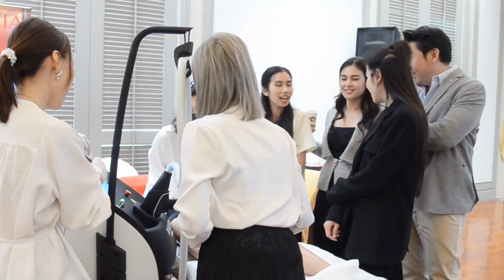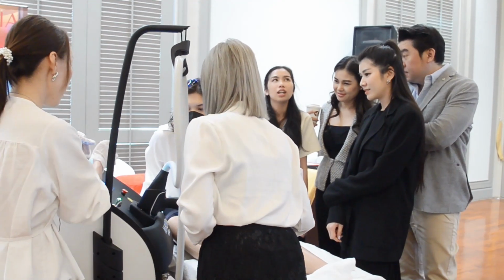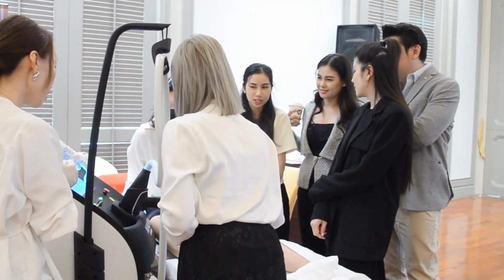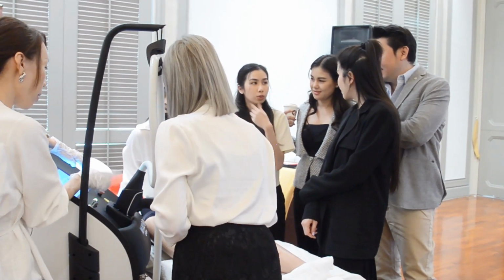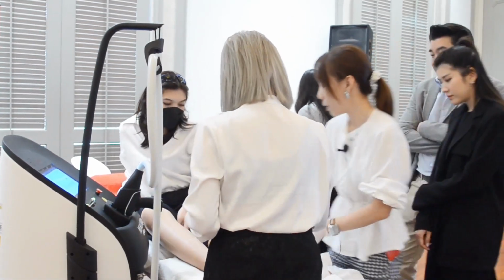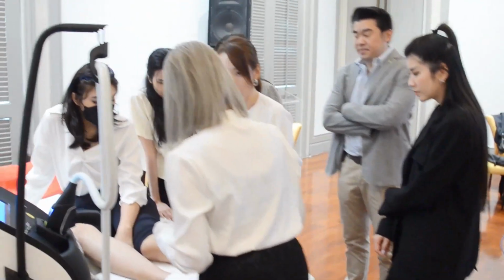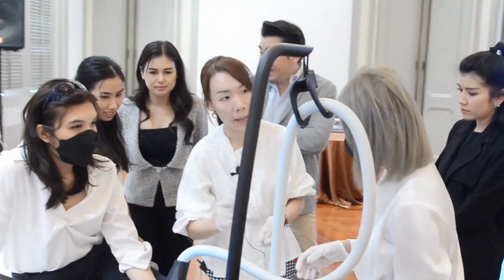Okay, energy 5 or 6. The max is 6 because all this is already prefixed and today is the first session. Okay, so we do this. When this goes off, it means that your device, your handpiece is ready, but we do not shoot first. So what I want you to do is take the handpiece with 2 hands and move to get familiar with the motion. And if you're familiar already, then you start to press on the button.